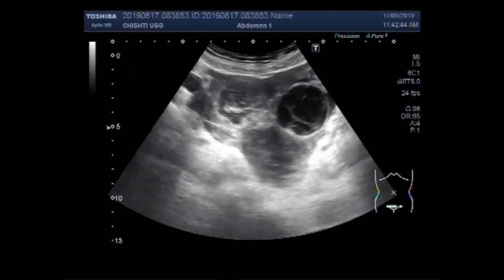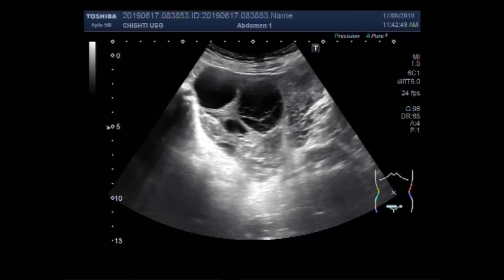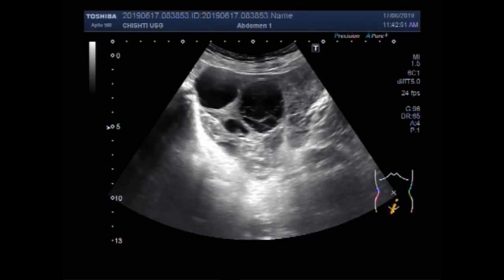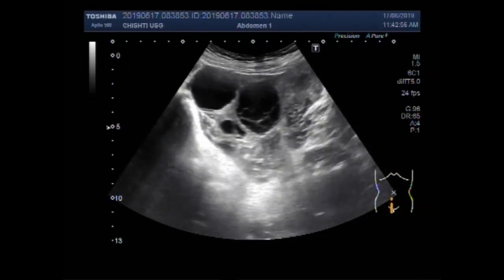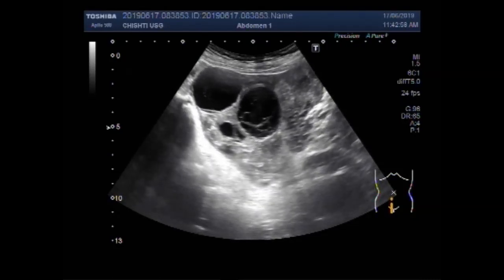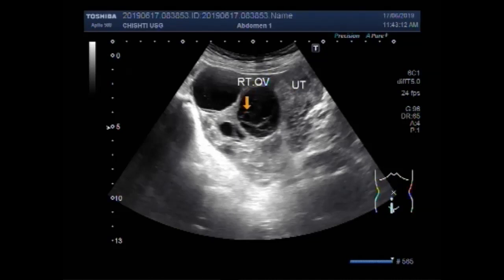Now you can see three cysts. These are two of the three cysts seen in this patient. This is the uterus, this is the right ovary, this is an ovarian hemorrhagic cyst, and this is a simple cyst.